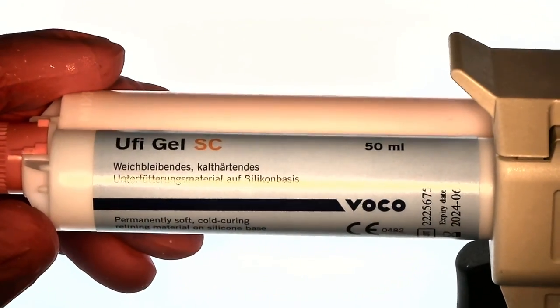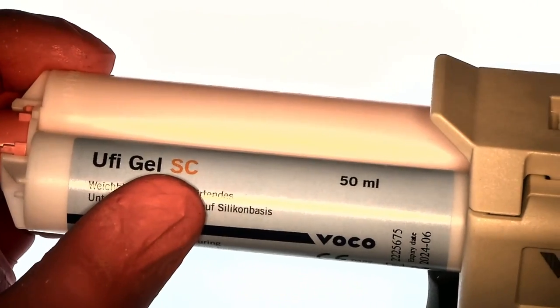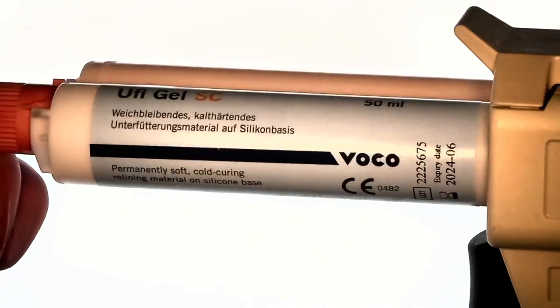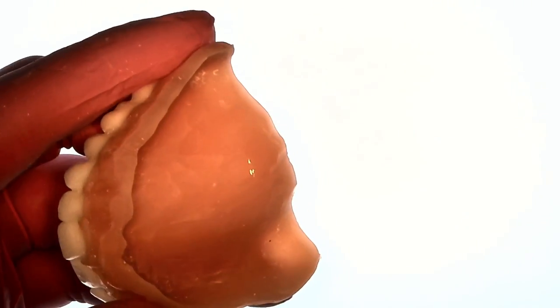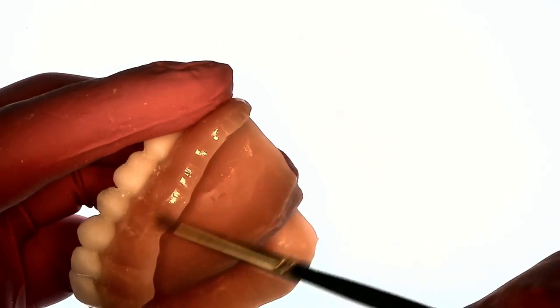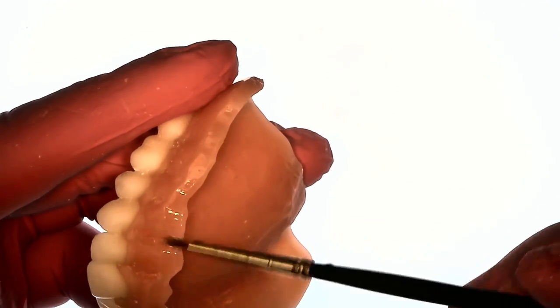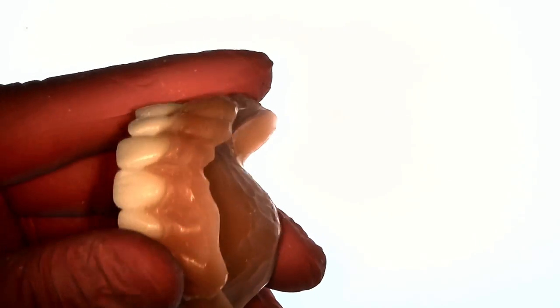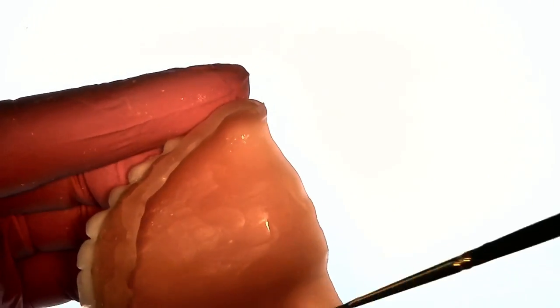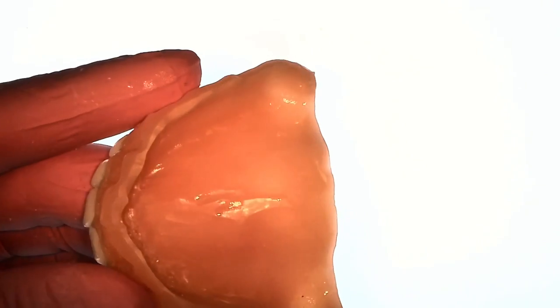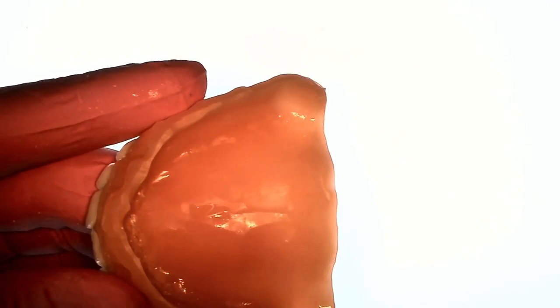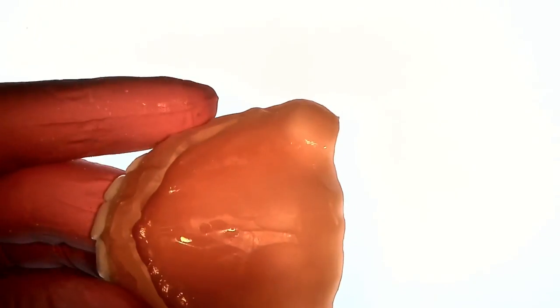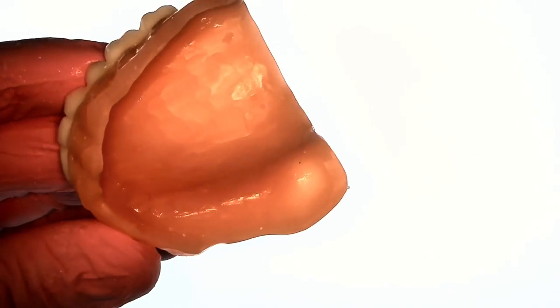Now this is the product, it's a VOCO product. It is a permanent soft reline but I also use it as a tissue conditioner because I find it very friendly to the soft tissues. It's a silicone based product, very biocompatible. The first thing is on your dried surface you need to paint two coats of this adhesive all the way around. Extend just a little bit beyond your chamfer margin there on the borders of your denture and apply a thin coat everywhere and then air dry it.